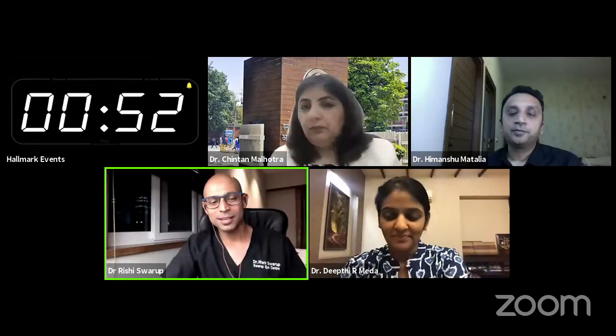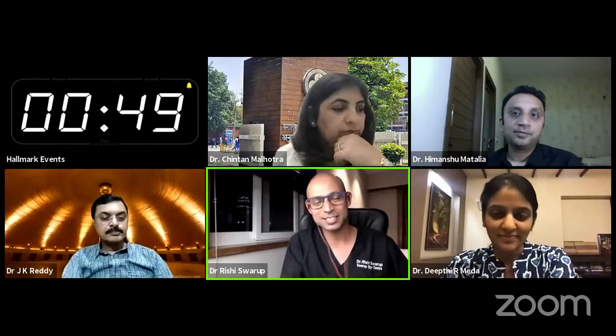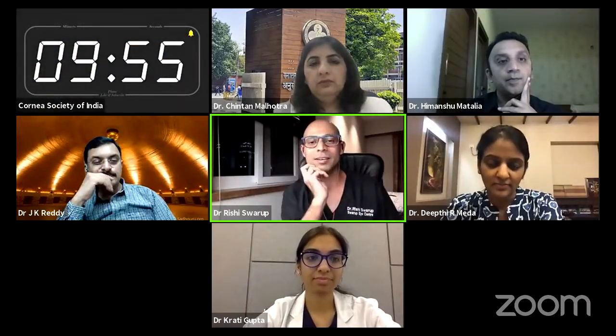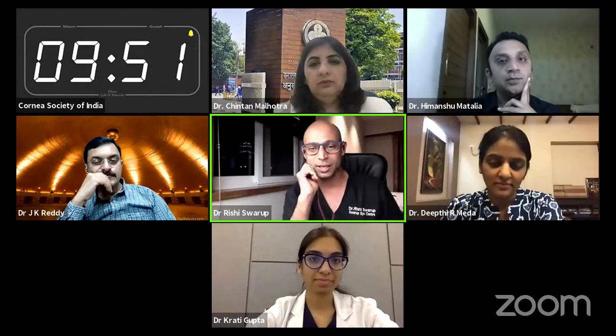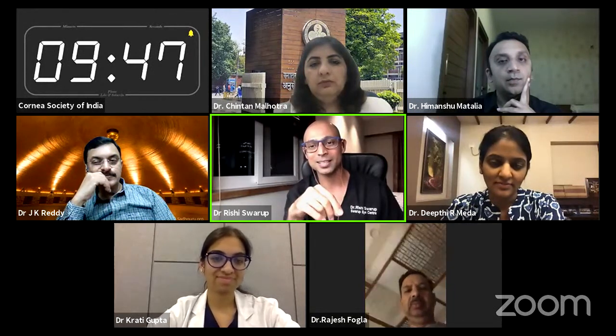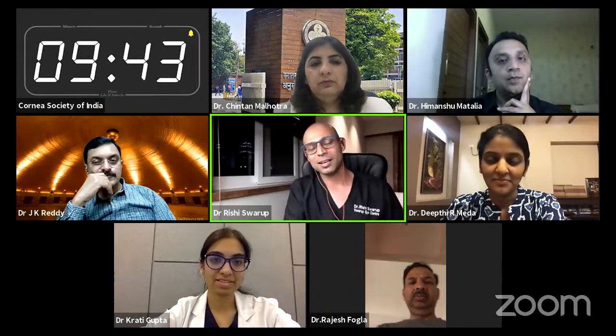So Krati and Deepti, both your presentations were very innovative and very interesting. I'll start with Krati's case. It was obviously a case of post-PRK haze, but unfortunately it was a very irregular haze with a couple of hills and a little central island, and that can be a very challenging case to treat. And I must compliment you for the accuracy with which you managed to do the PTK. I think that's only possible with the Schwind. I'm sure you used the Schwind MRS.